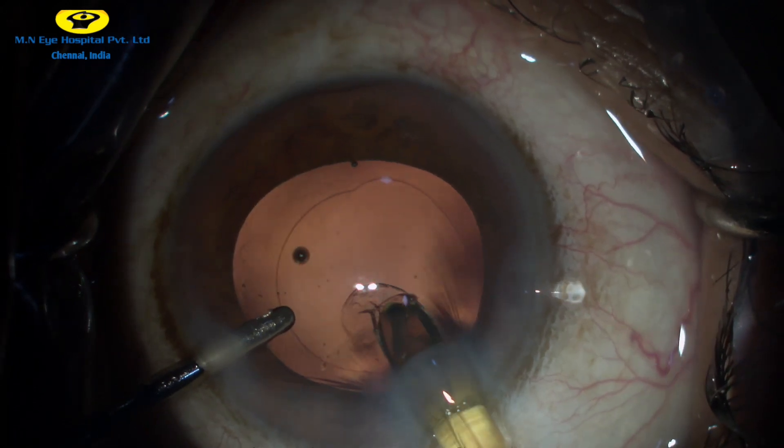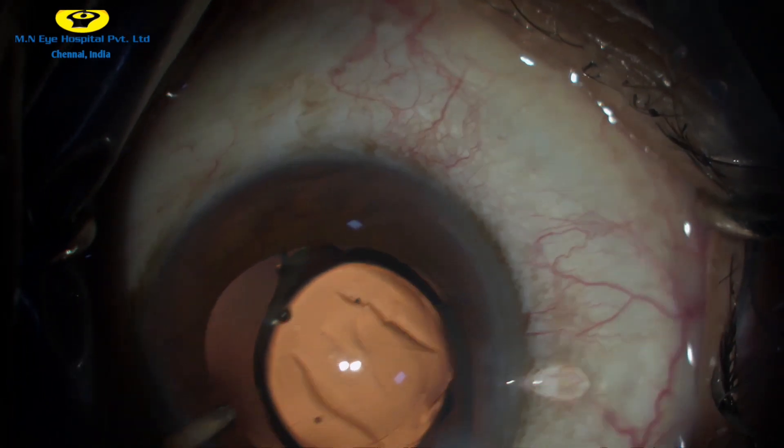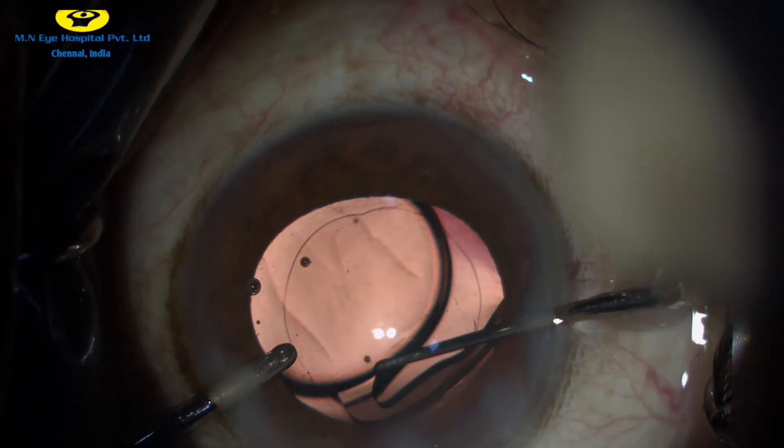Under irrigation, the foldable intraocular lens is then injected into the capsular bag. With the help of a Sinskey hook, the trailing haptic is also dialed into the capsular bag.